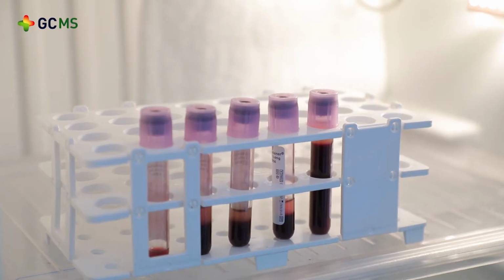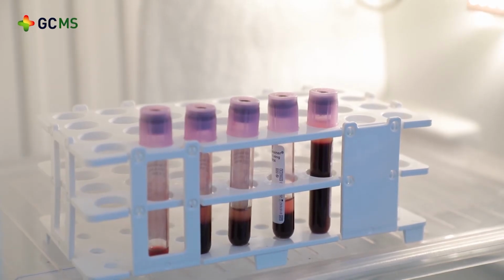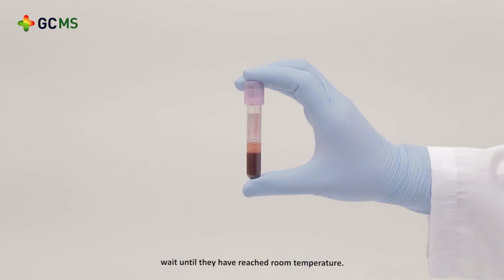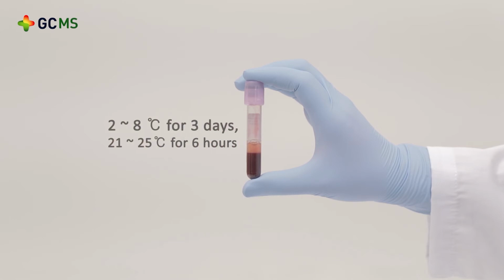You can also use a venous sample to measure a lipid profile. Remove the venous sample from the refrigerator and wait until it has reached room temperature. A venous sample can be stored in the sealed tube for 3 days at between 2 and 8 degrees Celsius, or for 6 hours at between 21 and 25 degrees Celsius.